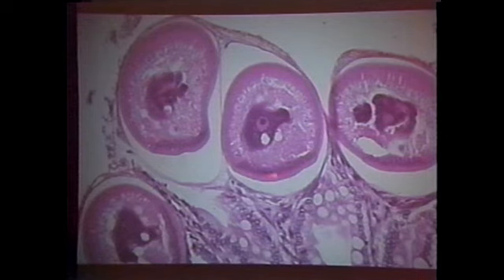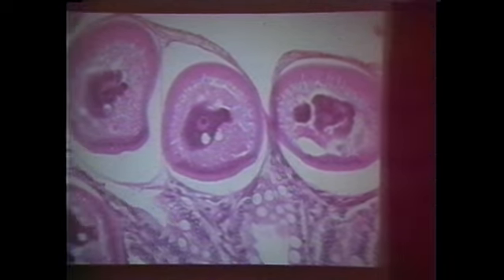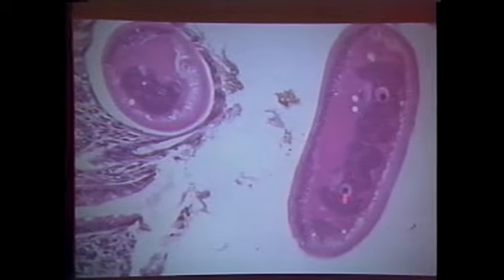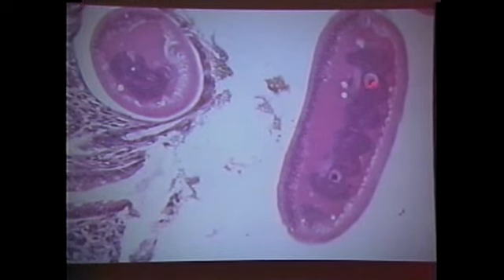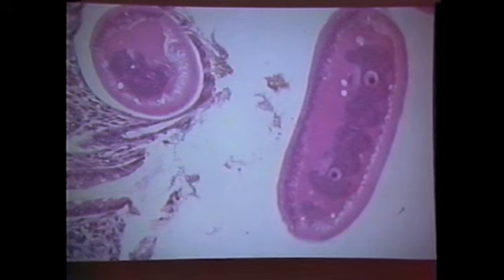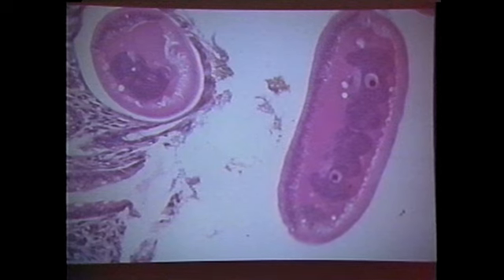Right here, this basophilic structure. And usually it's in close approximation with the tissue itself, and some people think they use it to suck up things. I don't know. But another structure that all aphasmids have is a stichosome. And that is a body that surrounds the esophagus. Okay? The esophagus is surrounded by a bunch of donuts. 3 or 4 will have one nucleus. And that's the stichosome, and it's like a gland cell that communicates enzymes into the esophagus.